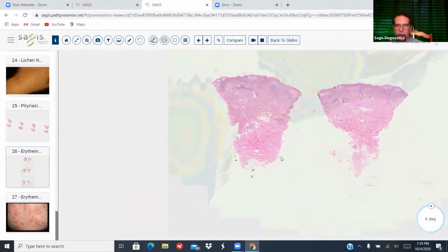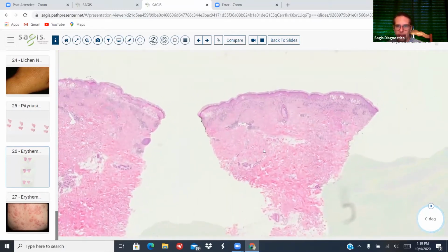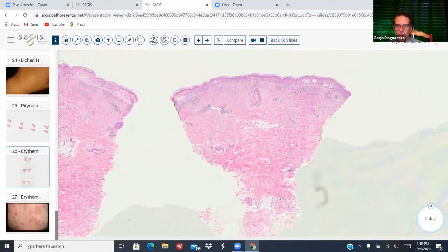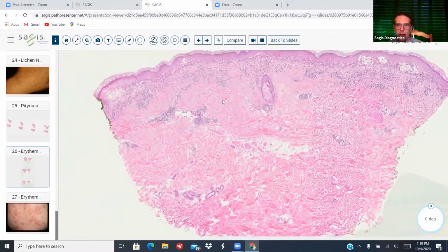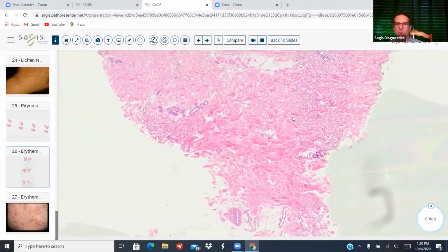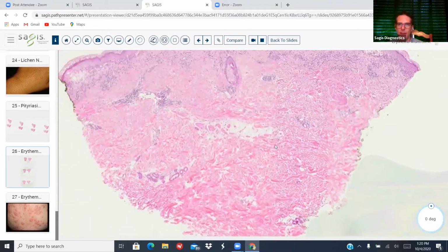Yeah, so let's find one that doesn't have a bubble on it. Okay, here we go. Yeah, this is formed by the cover slip lifting up and air getting under it, but it's sort of attaching to where the tissue is. So let's avoid that. Just for a little board tip on that, sometimes it happens and it makes sort of a brownish color when it goes over top, and that's called corn flaking. And that might be on the board exam as a possible artifact, because they like to ask artifacts.